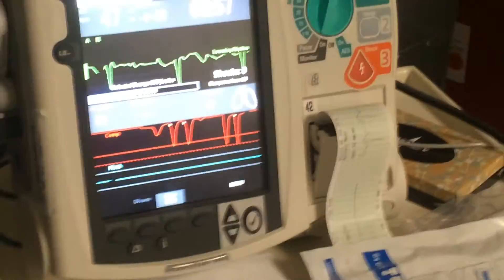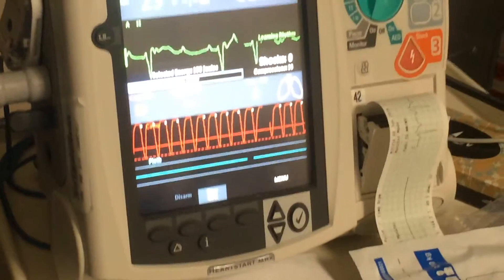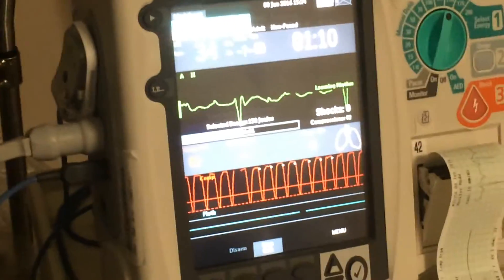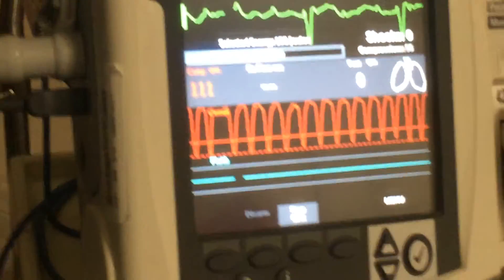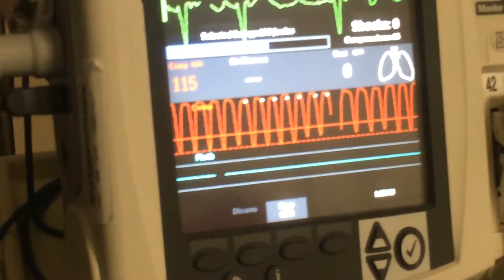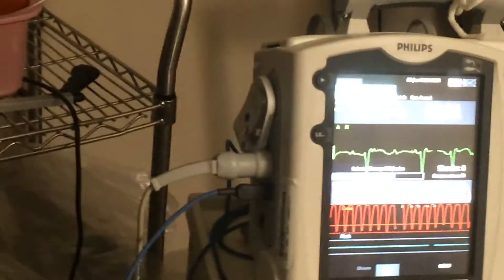Those are good compressions. The little white marks showing up are indicating that we're not doing full recoil. Come up for full recoil — there you go. We're getting better quality compressions but the rate is 90, so we want to go 100 to 120. Come up for full recoil, release pressure between compressions — there we go. That's what it should look like.